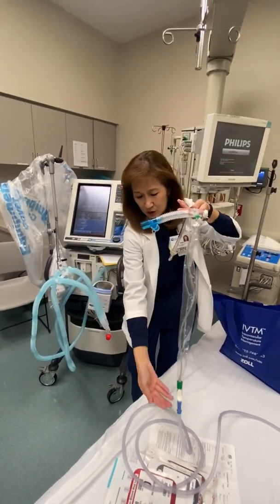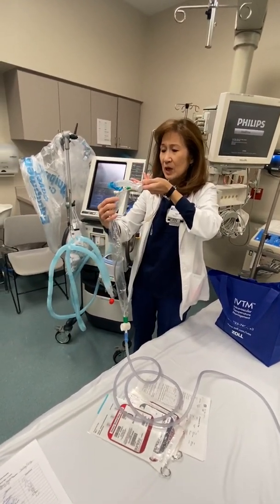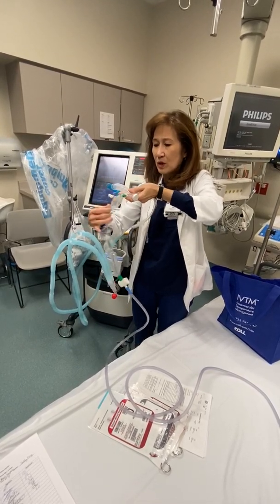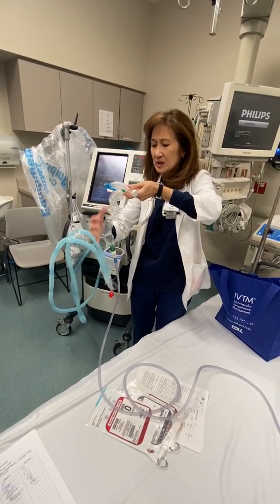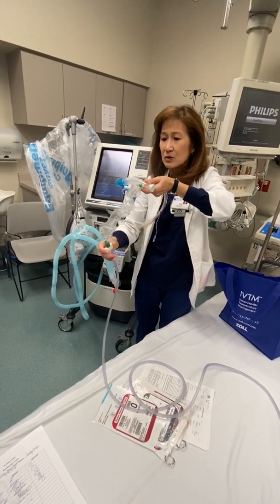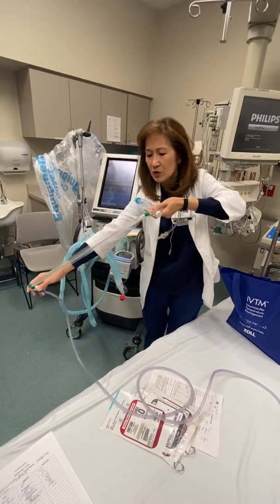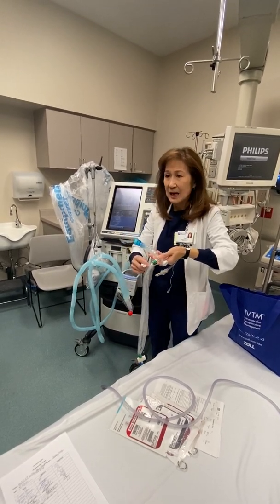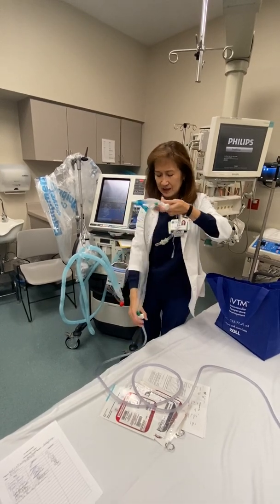Now you have all these secretions here. If you want to go one more time, you can give them another 15 seconds of breath, and then you're going to shuffle it in again. Hold on to your ET tube so that you can support it. Get it in. The minute the patient starts coughing, or the minute that you have a little resistance, pull back a little bit first so that you don't suck on the mucosal lining, and then apply suction. And wiggle a little bit to go around, and then you bring it all the way back, and that black dot should recede outside of the green. And now you're done suctioning. And you should leave it like that.